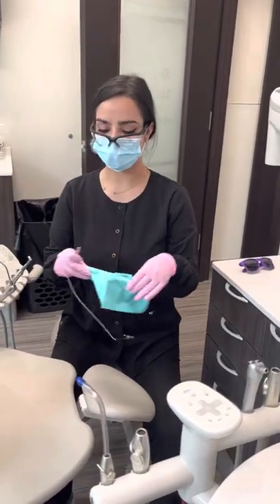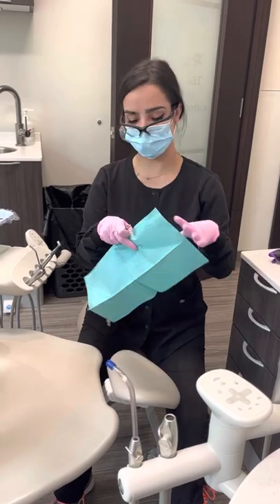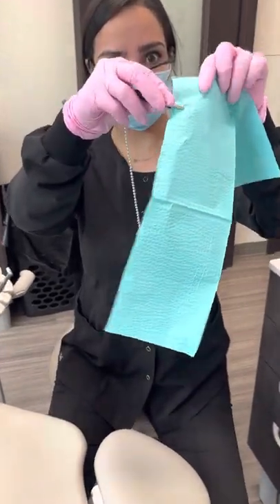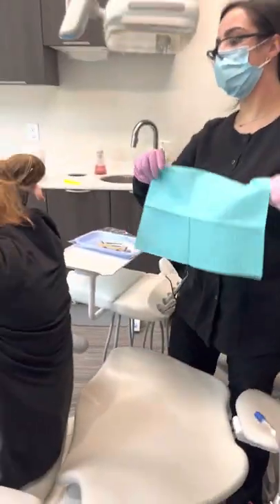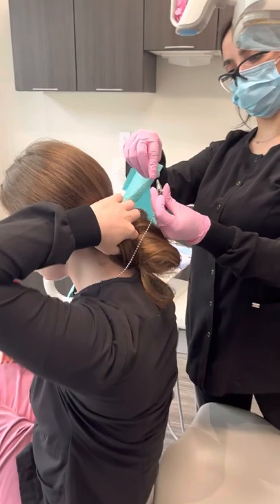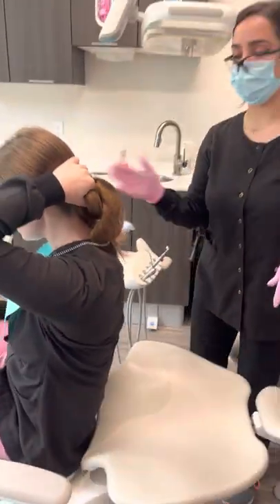First things first, we're going to use our bib clip for our patient. This will ensure that they do not get prophy paste on their jackets. Put one piece onto our bib, come around the patient like so, and attach on the other side. Then the patient will go ahead and lean back.